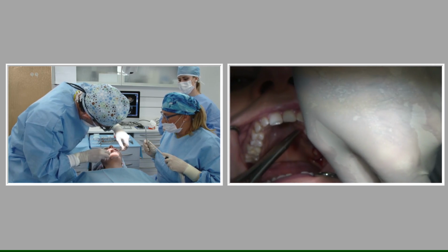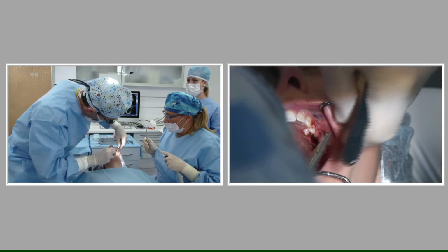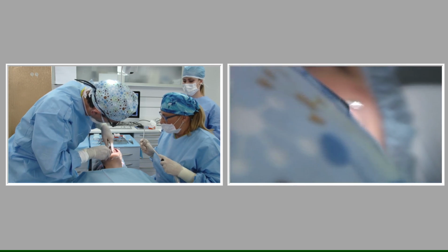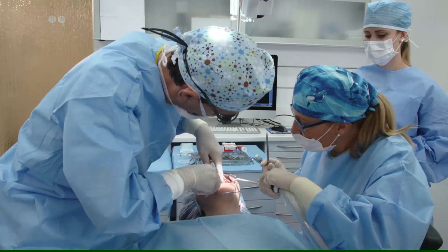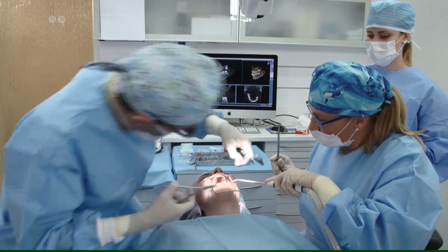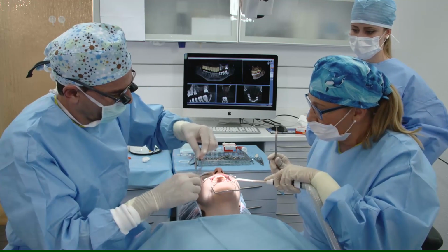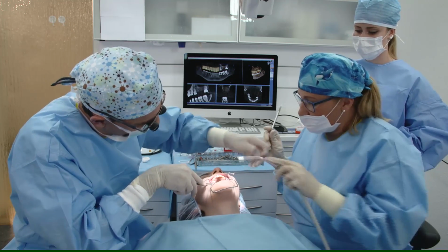Okay, this is real life like it is. Though we had prepared the abutments on tie base, we can't influence all components of such an operation. In this case, it's more important to get a predictable result, and if the primary stability of the implant is not given, we have to go the safe way.